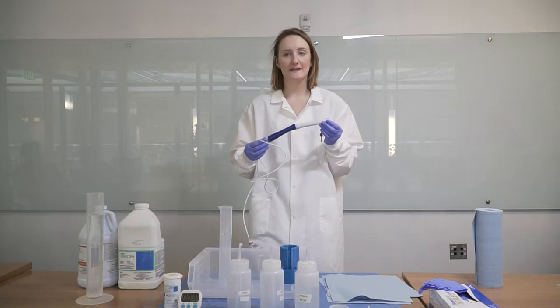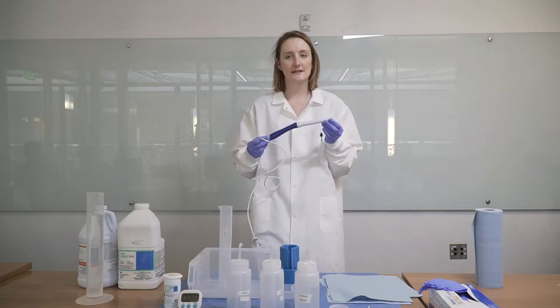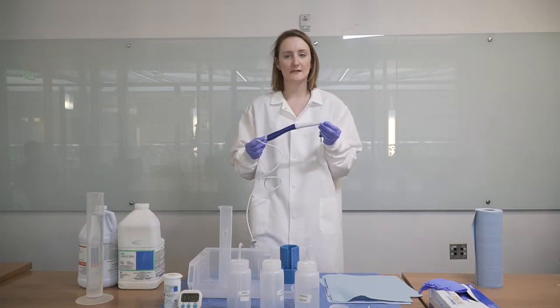Today we will be talking about the use and care of the pocket colposcope. We will begin by showing you the basic structure of the device and then we will discuss how to clean the device and how to use it in a clinical setting.